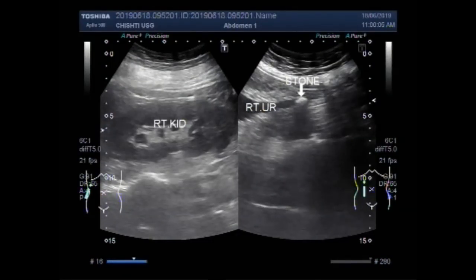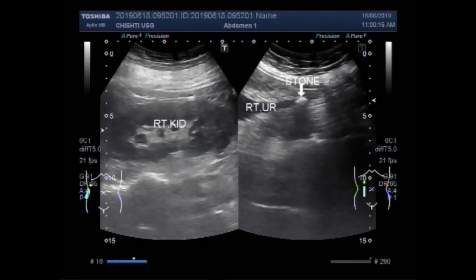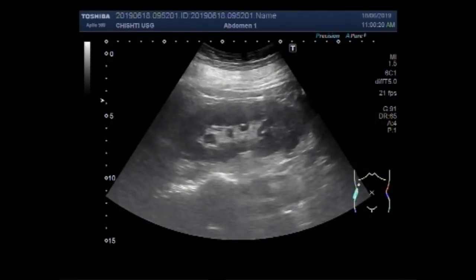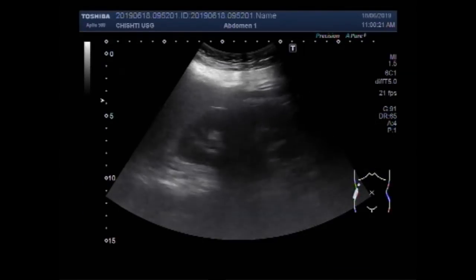Dear viewers, I hope you are all fine. This ultrasound video shows a stone in the ureter — a ureteric stone. You can see a stone in the ureter.